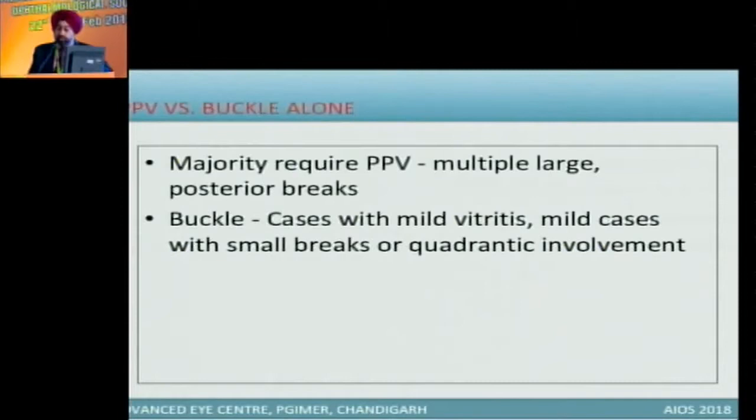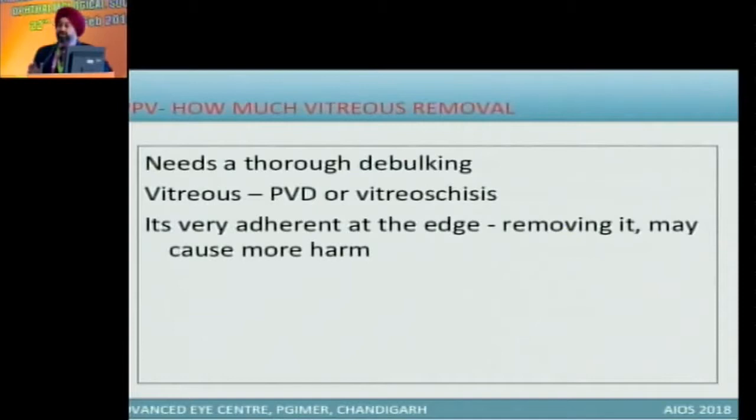Whenever you're doing PPV in these patients, you need a thorough debulking. You will find most of the times a PVD in ARN, but you will not find a PVD in CMV retinitis.